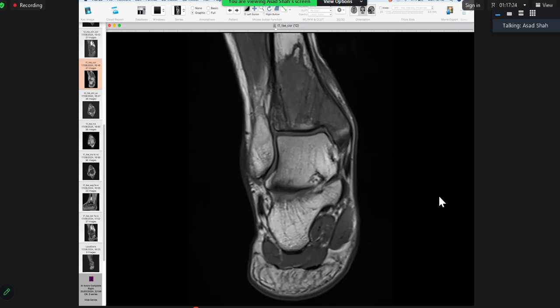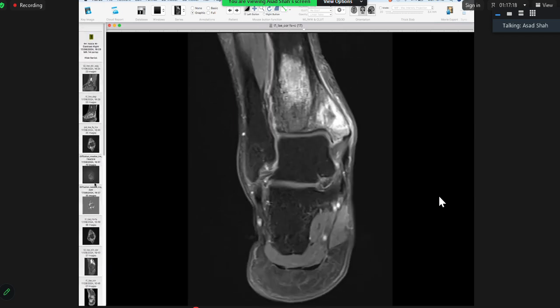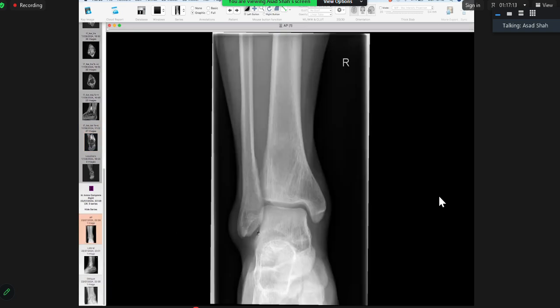So the tumors, I mean, they can be weird, but it needs a biopsy and it is biopsy proven. It came back as Ewing's. But you spotted it very well on X-ray, I must say. People say, is there a history of trauma? Sarcomas can present after trauma, whether this patient has been having some pain, hobbling on, and then he just kind of tripped off a stair or something. So trauma and tumor, they can interplay. One does not exclude or make you immune from the other. So that's just the point to keep in mind.